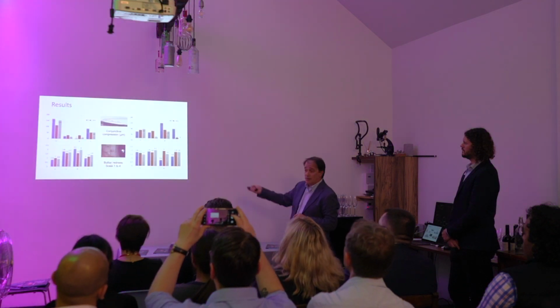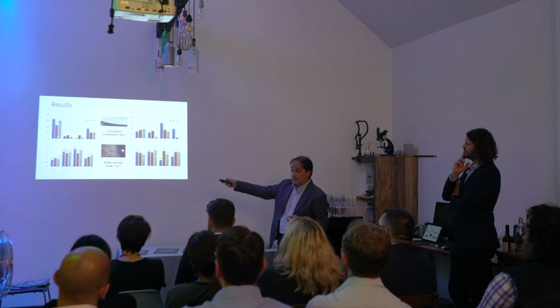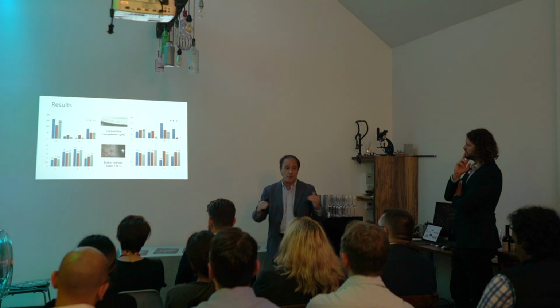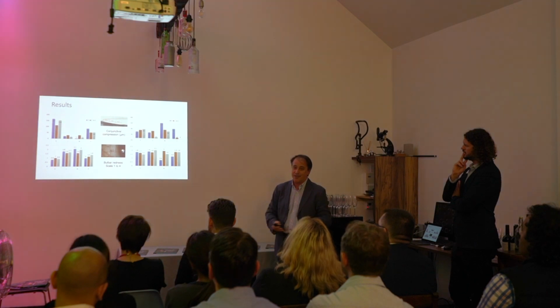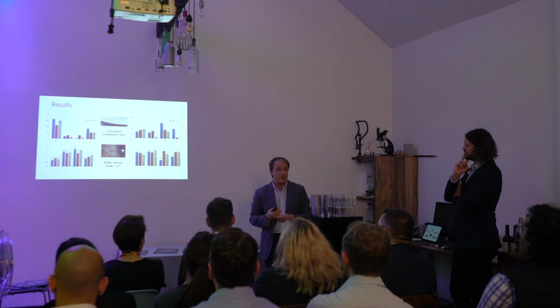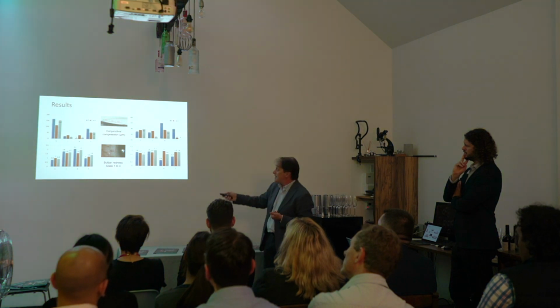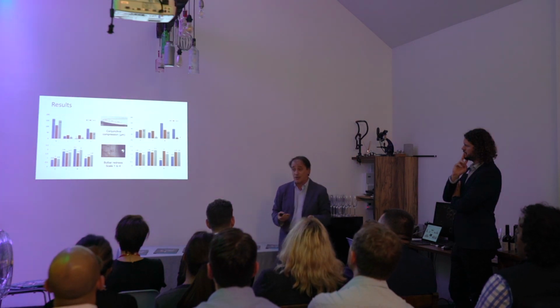Using this value, we plot the results considering the compression in the three different areas and the different behavior in four quadrants. And as we can see here, the sclera is not regular. In normal patients it's not regular, but in the case of irregular cornea too, because we do not have the same compression in the four quadrants. And this is the first condition. And we have support for this result using the AOS software too.